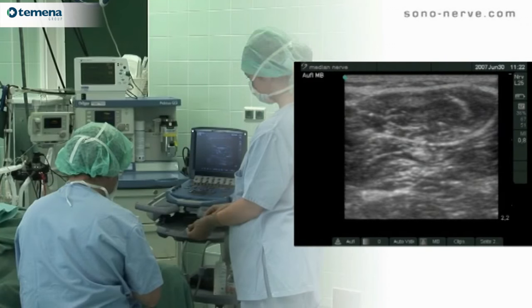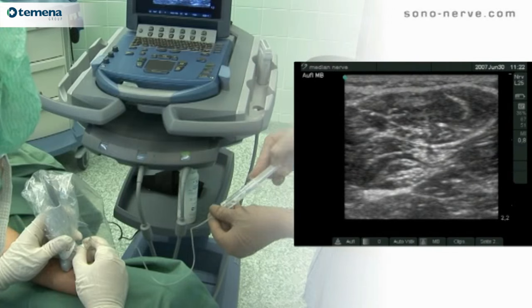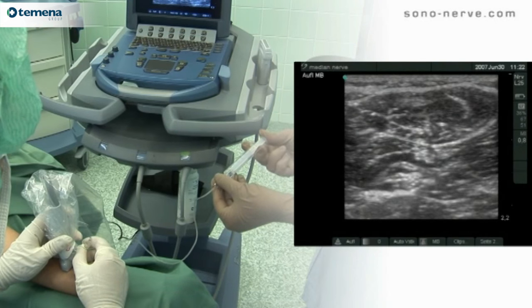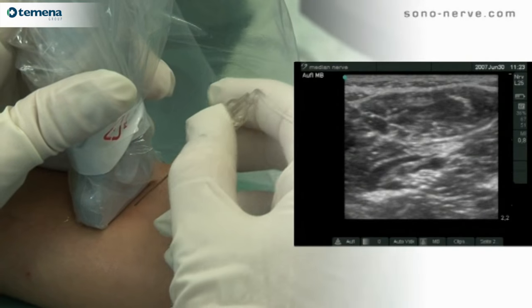Notice, if you will, the particularly oval appearance of this nerve. Regular aspiration helps prevent accidental intravascular injection. The needle is then withdrawn.